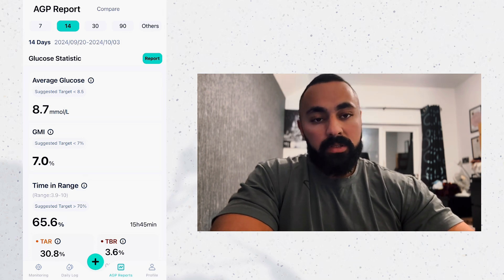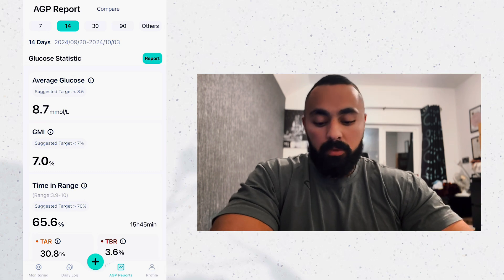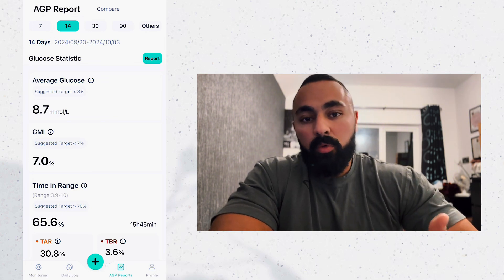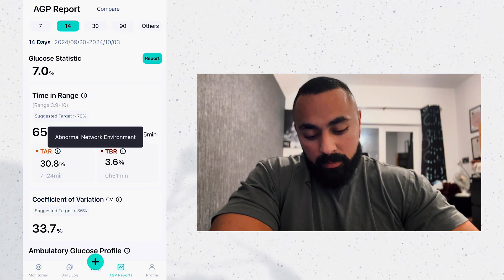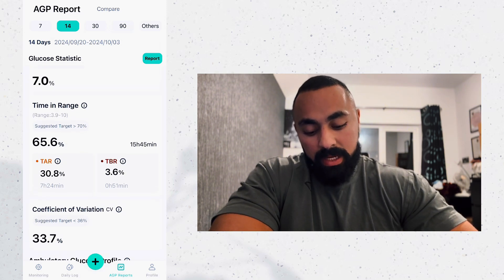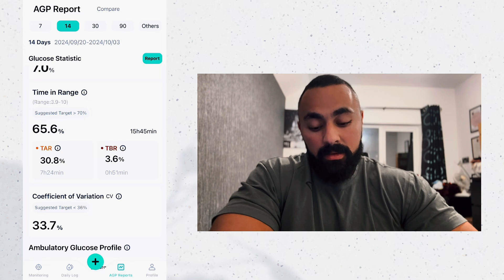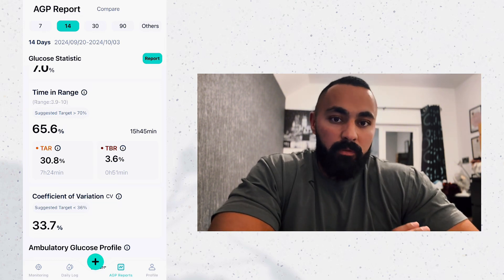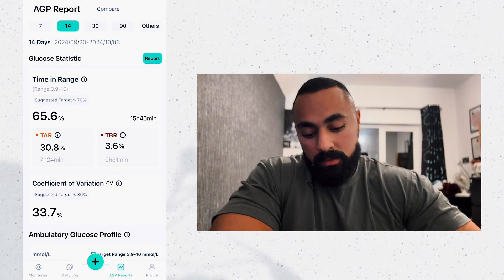GMI is the glucose management indicator — it uses average sensor readings as an indicator of how well your glucose has been controlled. It's similar to the HbA1c test. HbA1c covers 90 days, so if you click 90 days this would be your HbA1c equivalent — here it's 7%. My target is definitely lower than 7%. If your HbA1c or GMI is 7% it's not the end of the world — you just work on improving it. Scrolling down, you get time in range, which again shows the range of your target.